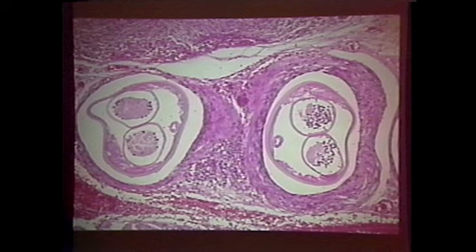This was an incidental finding, the outside of an eye. And look, we have worms, so we get excited. Some worms excite us more than others. All right? So, now, let's look at the morphological characteristics that I've taught you. All right, what's the intestine like? Small. You see, y'all have learned something. You have got your money's worth, and you didn't think it was worth it.